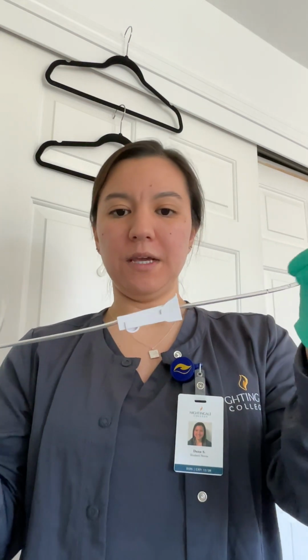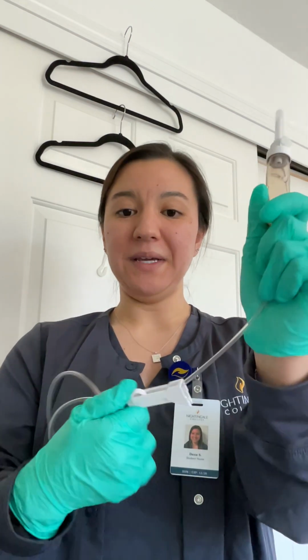And same thing with our piggyback line. Spike end, keeping it sterile, not opening it until you're ready to spike your bag. Drip chamber, we're going to fill it halfway, making sure that we're able to see the drops coming in and making sure that there's air in there so that air can go into it instead of into the tube. Same thing with the roll clamp. All the way down means nothing is coming through. All the way up is going to let the fluid free flow through the tube, and you are going to be controlling the drips per minute with this roll.